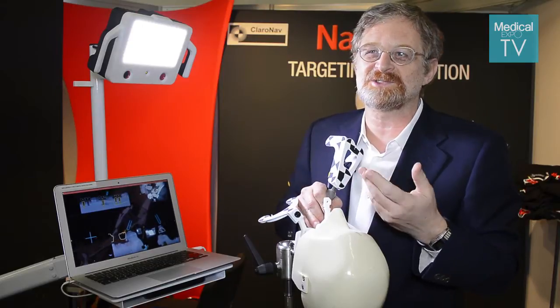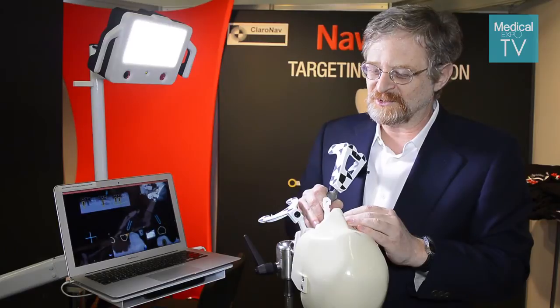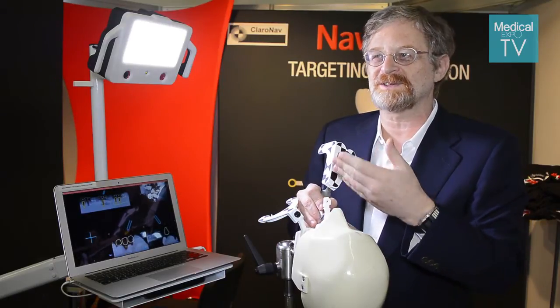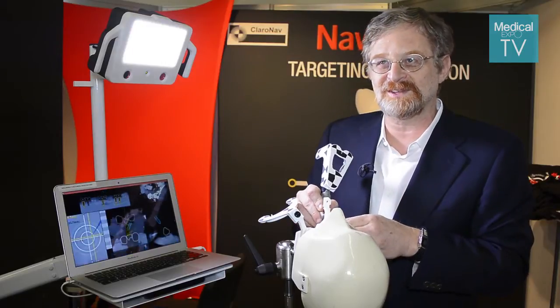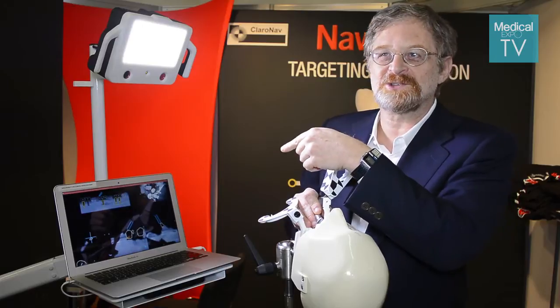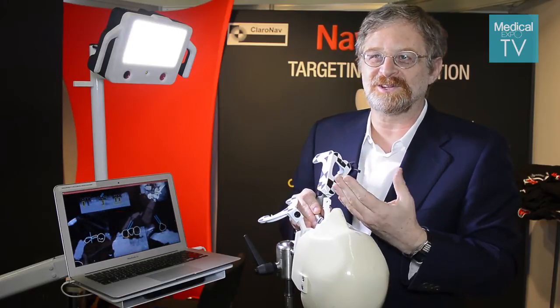We find that it usually takes one or two patients and they get used to it. They just need to verify initially that the system is accurate. The accuracy verification takes just a few seconds — they touch a few teeth and they see that wherever they touch in the mouth is actually what is shown on the map on the CT. Once they do that, they gain the confidence that the system is accurate.